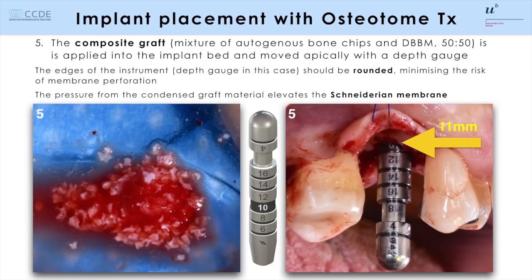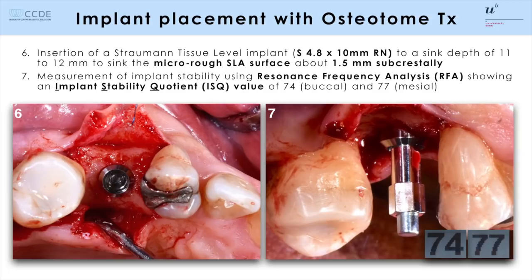The depth gauge is inserted to a sink depth of about 11 millimeters. As next, the wide body tissue level implant of Straumann is inserted without pre-tapping the threads to optimize primary stability. The micro rough SLA surface is positioned about 1.5 millimeters below the crest, leaving the implant shoulder in a supracrestal position. This hybrid designed implant is used for more than 30 years at the University of Bern and has shown excellent long-term stability in multiple clinical studies.